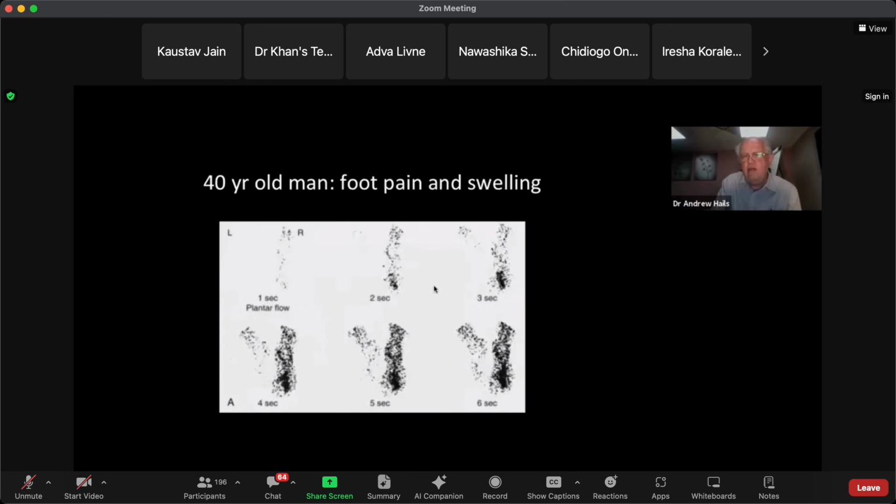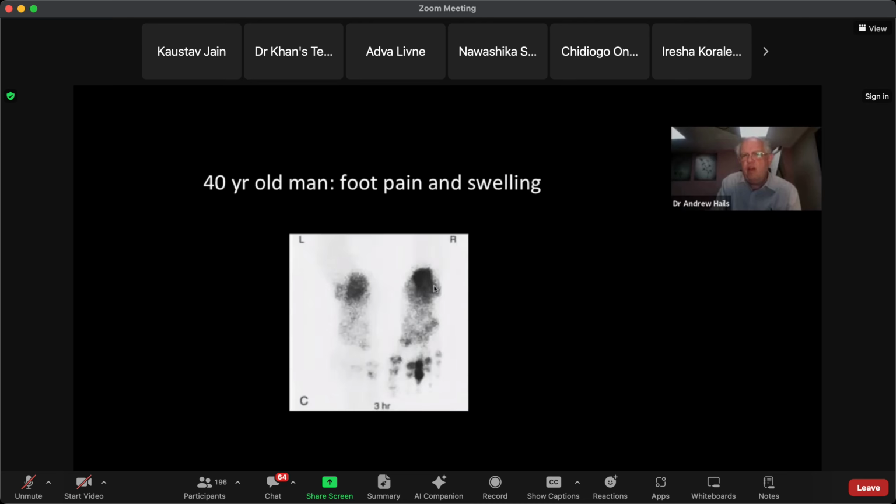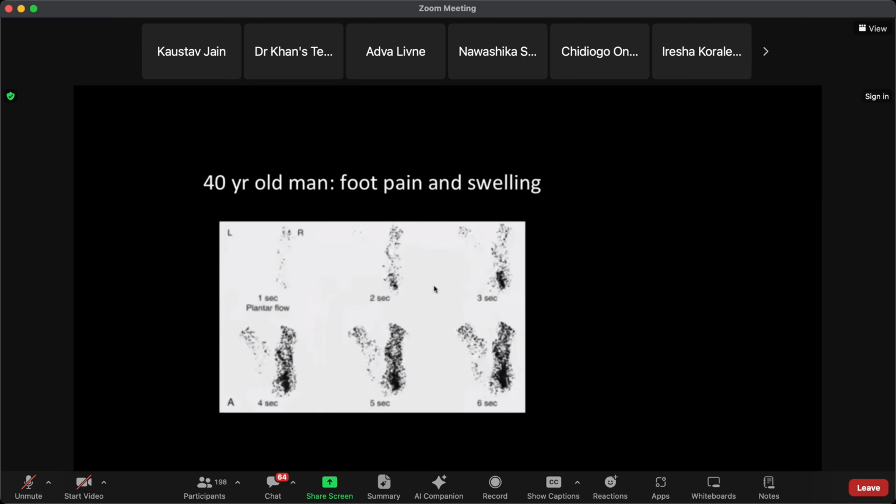Right, okay. And what kind of problem might this person have? It will be due to hyperemia. The patient may have a focal infection or osteomyelitis, which is causing an increased amount of blood going to that area, and therefore the increased uptake on that side.